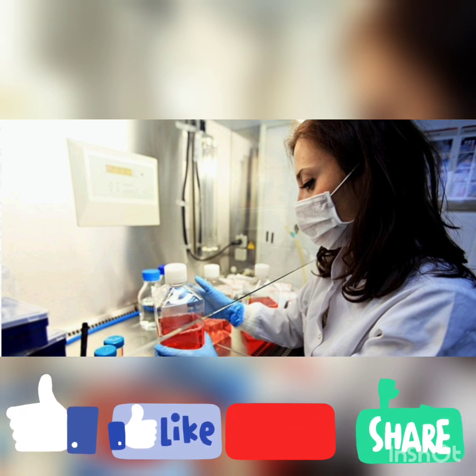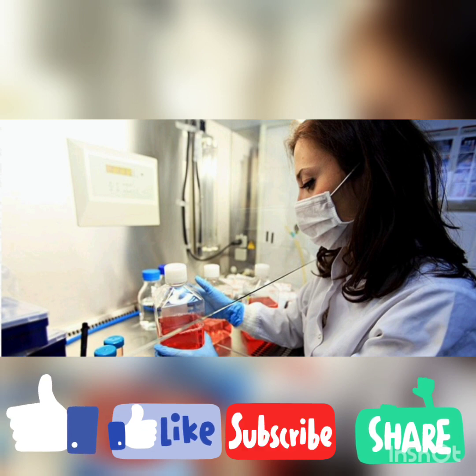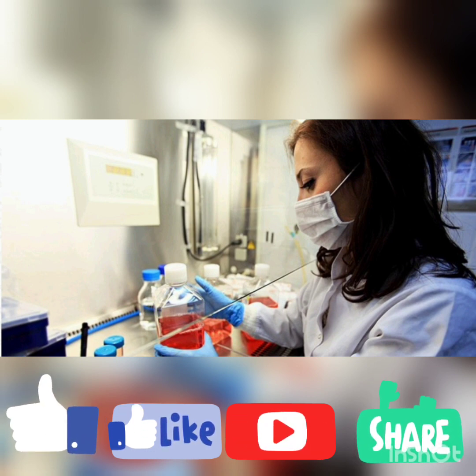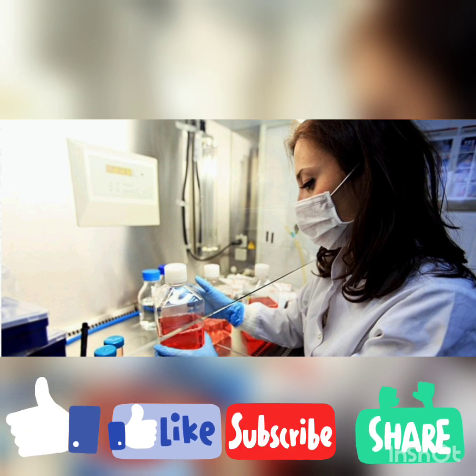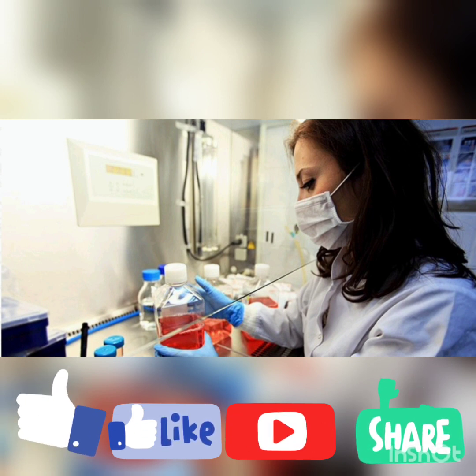So if it is clotted blood for a virological study, you can keep it in the fridge. And a specimen which is submitted for virus isolation needs to be frozen immediately. If it is a clotted blood specimen, you can keep it in a fridge, not a freezer. So this is about handling of specimens in the laboratory. That's it about this topic.